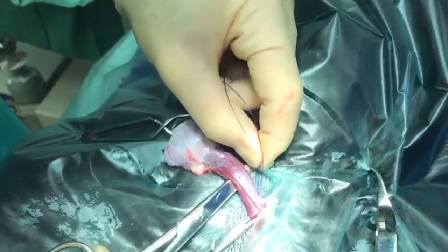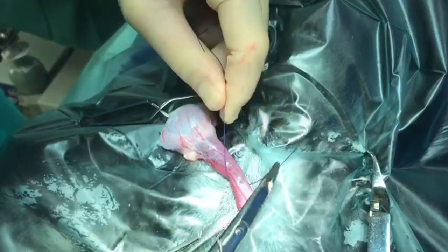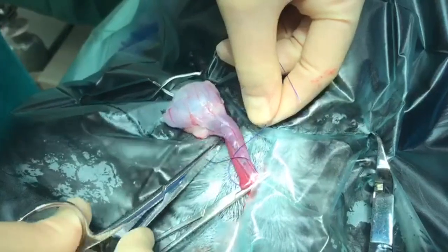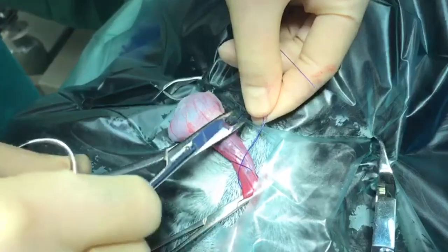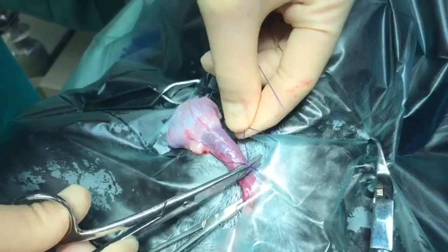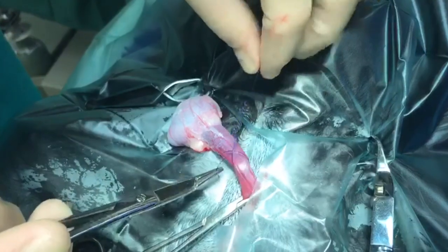The best synthetic suture material to use with this knot is polydioxanone or PDS. Try tying this constrictor knot with PDS around a piece of carving rope — once tightened you'll find it difficult to undo. This knot pattern tightens easily but does not release that tension on the first throw, making it ideal as a ligature.